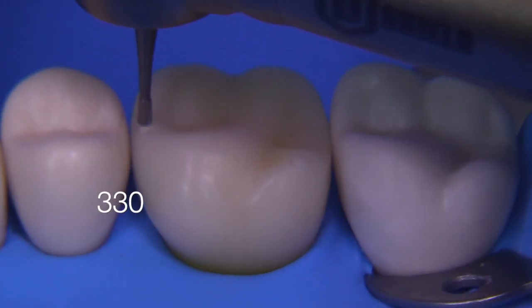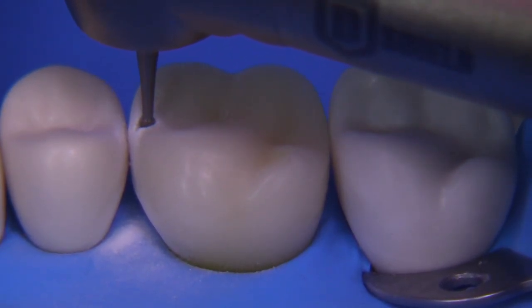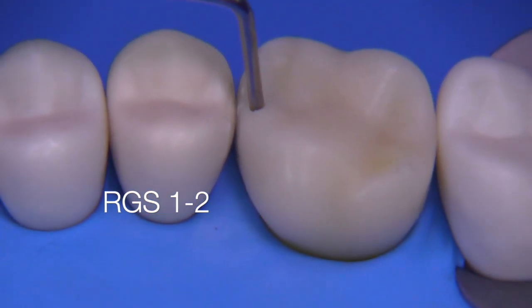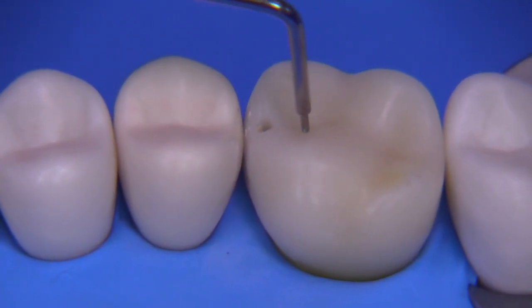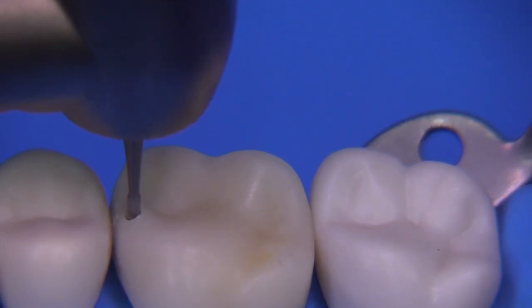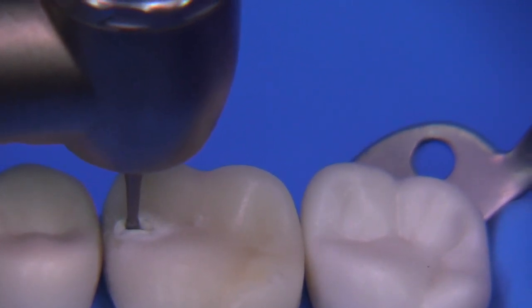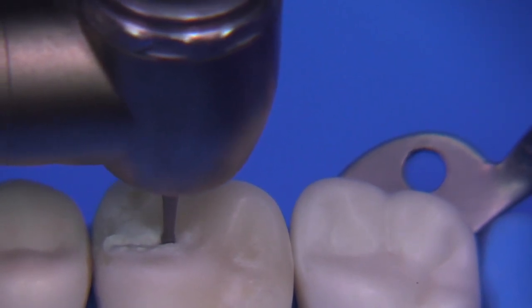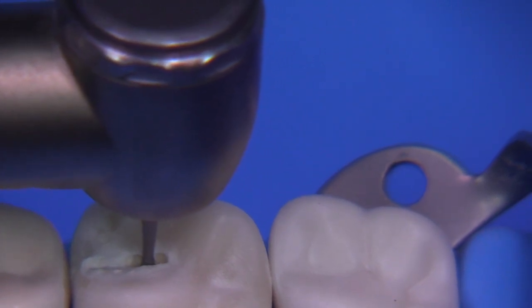I really have no idea what I'm in for here, so we're going to start with a 330 as we normally would, with a little punch cut to 1.5 millimeters. The material is hard — it takes a few attempts to get down through it into the softer dentin underneath, which is quite soft. The difference between this shell of enamel and the dentin underneath is significant. You can see how I'm almost hesitating as the bur is moving through — it's quite a bit harder than the typical tooth made by any of the typodont manufacturers, and certainly more rigid than the typical Accadental tooth.